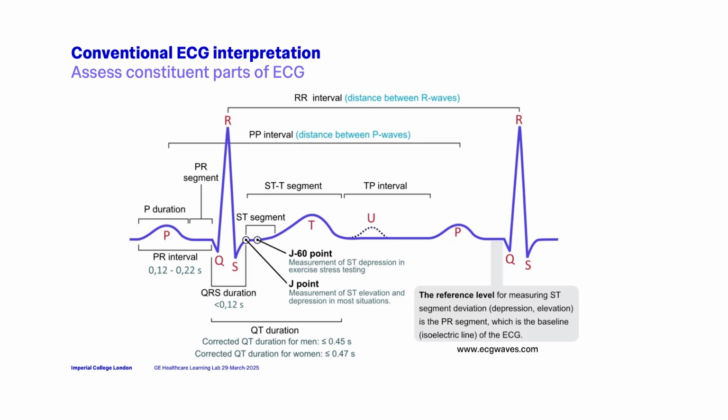And we've used that framework to our advantage for many years. But at the same time, I think that framework has really restricted us from unleashing the full power of the ECG, because we are trapped by very strict ways of how to look at and interpret the ECG.